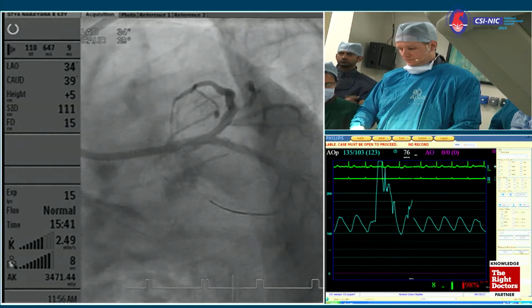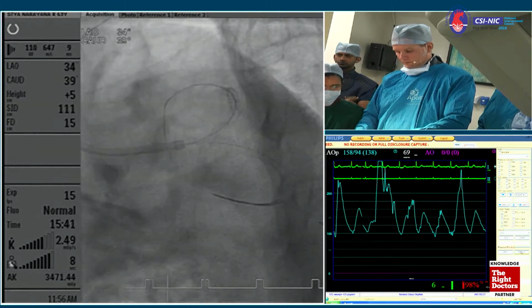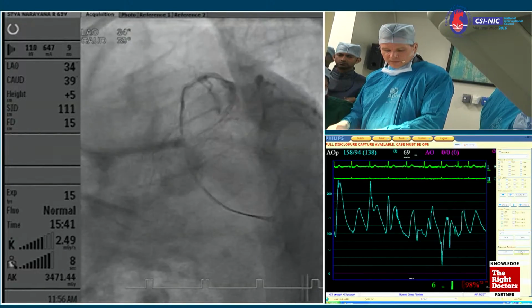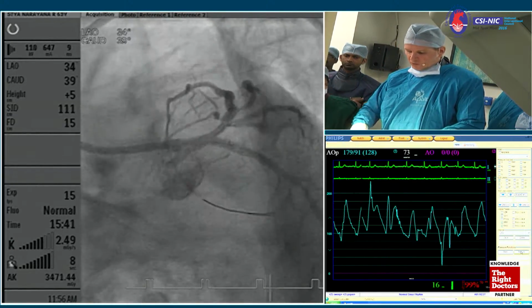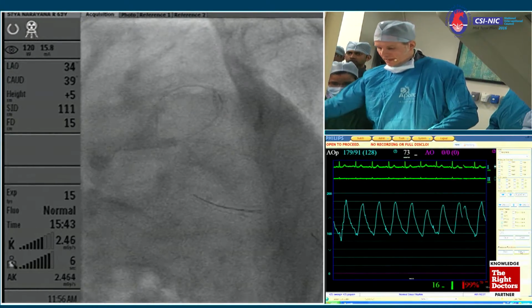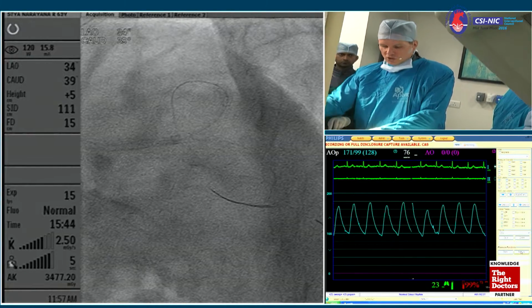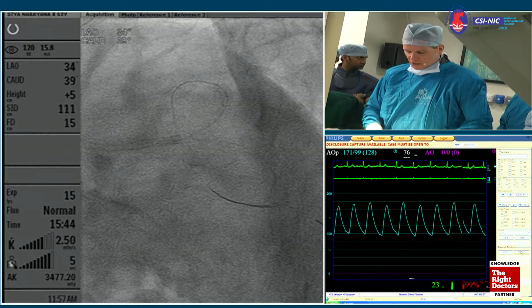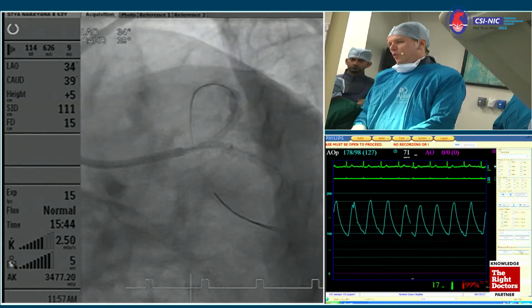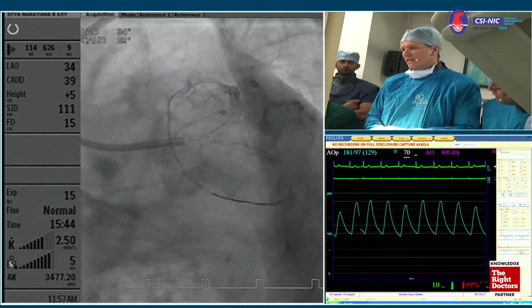Dr. Naber, I had a question. In your routine practice, do you do these left mains without imaging? You should stent because you always do imaging. No. I use imaging if I have a question which I can clarify. I never use imaging without a clear question that I have. And here I now have the question, should I stent the LAD ostium? Because you were citing Dr. Fajadet, I was working with him for some time. What is the percentage of time that you have a question to be answered with imaging? Well, I would say maybe in 30% of cases, I would like to take a look.